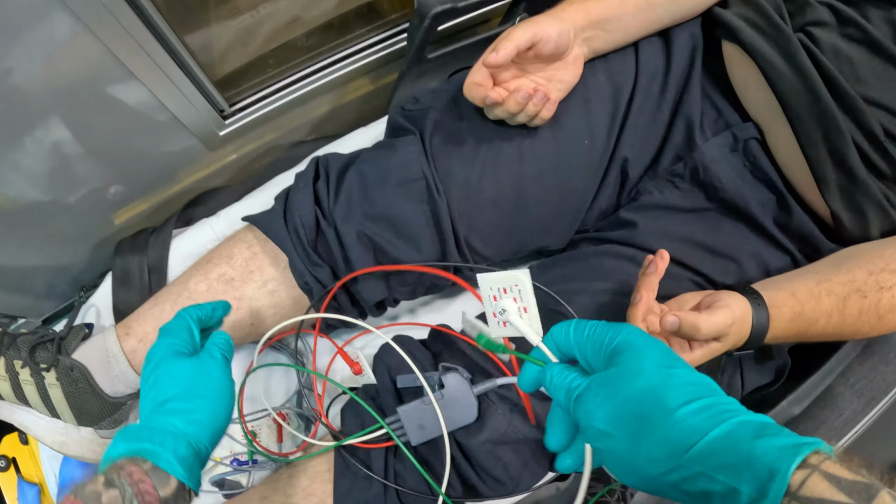So I basically just want to show you what I did. I found the manubrium right here. This is the second intercostal space. This is the third, and this is the fourth. I feel the hole in between the two ribs. Fourth intercostal space to the left and to the right of the sternal border is where V1 and V2 are going to go. So I'm going to take V1 and V2.